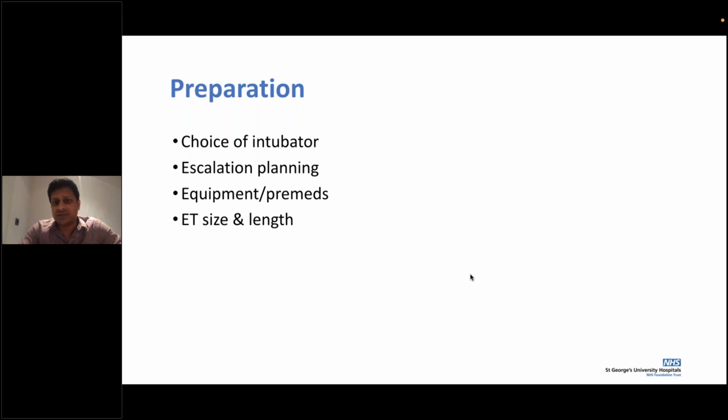Would that routinely be the most junior colleague within the team, who needs some practice with intubation, or the thought process around intubation? We'll come to that point in a while. Then there is escalation planning: what happens if the initial intubation is not as planned, and how do we prepare ourselves? What kind of equipment is absolutely needed? What are the pre-medications? What is the ET size? And some tips around the length of ET tube that needs to be inserted.